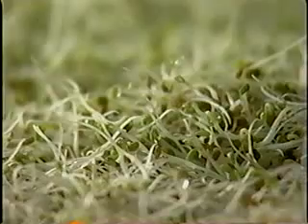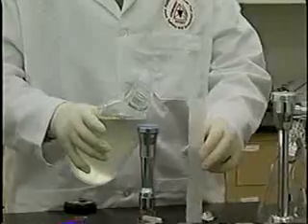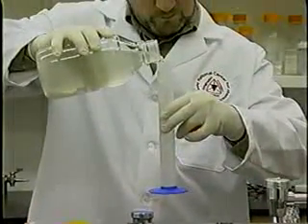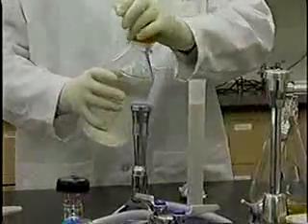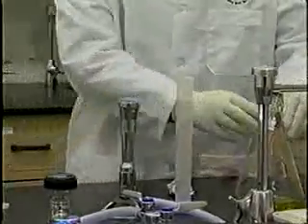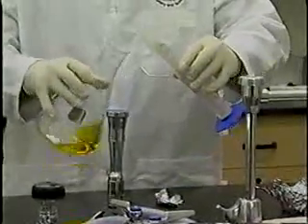It is strongly recommended that all testing for pathogens be conducted in a qualified, independent testing laboratory that meets several key criteria. As mentioned earlier, such a laboratory should be physically separated from the sprouting facility to prevent cross-contamination of the sprouts from test materials. Conducting these tests requires the use of cultures of pathogenic bacteria, which could pose a hazard both to the workers and the consumers if not done properly.